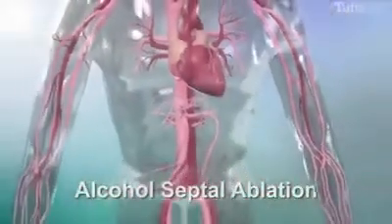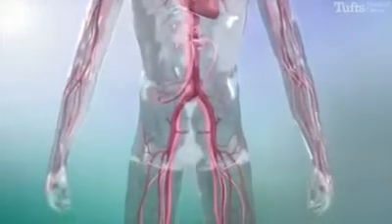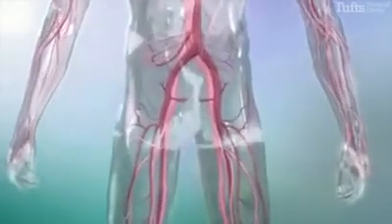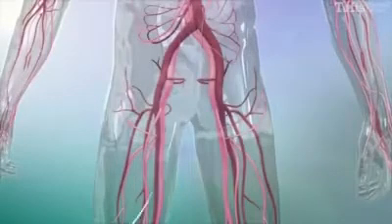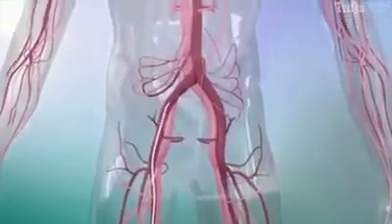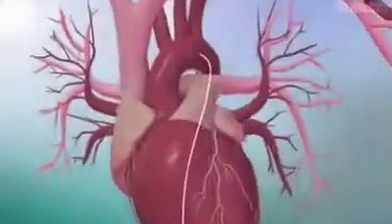Alcohol septal ablation is a minimally invasive catheter-based treatment performed to reduce the thickening of the heart muscle, specifically the ventricular septum. During this procedure, the femoral artery is accessed and a catheter is advanced from the leg until it reaches the coronary artery supplying blood to the thickened septum.